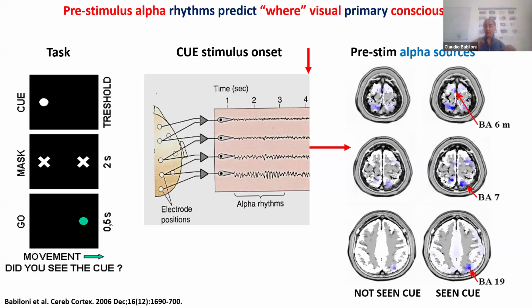We had the reaction time to demonstrate that the subject was following the task, and we had the simultaneous EEG recordings during the task and the possibility to analyze the alpha rhythms before the cue stimulus and during the task.